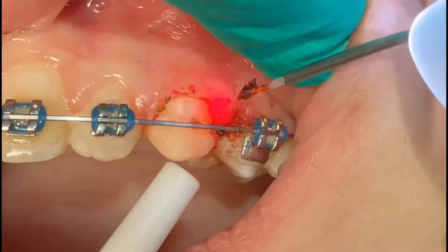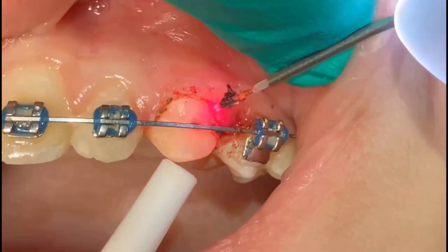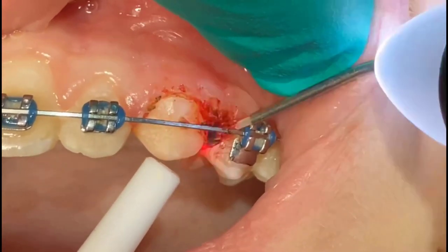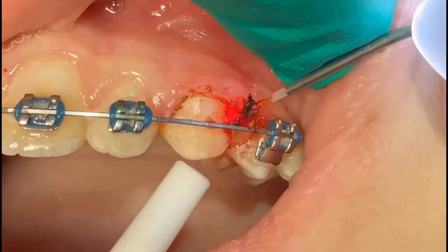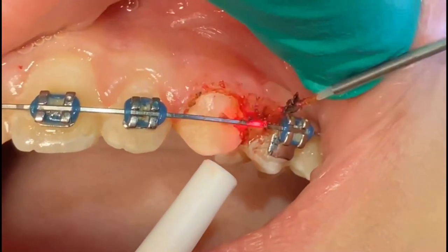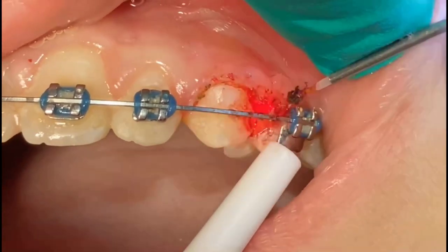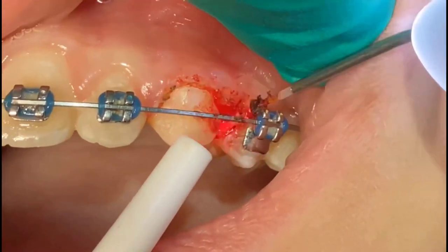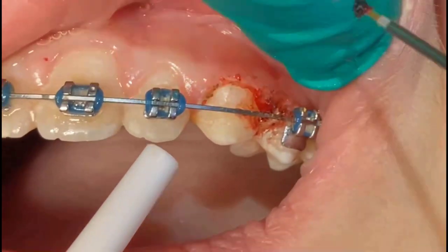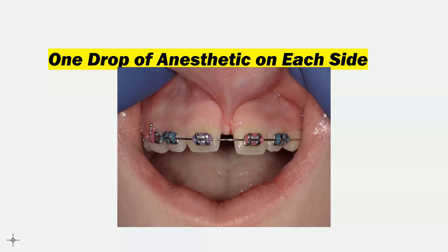So we do have some moderately thick tissue here, so I'm just going to thin things out a little bit, and then we're going to be done with this tooth. I'm just snow planing or snow plowing now the tissue to thin out that inflamed papilla. See now how cleanly we've exposed these teeth. We're going to do a little modification right here in the center. Turn to me a little bit.